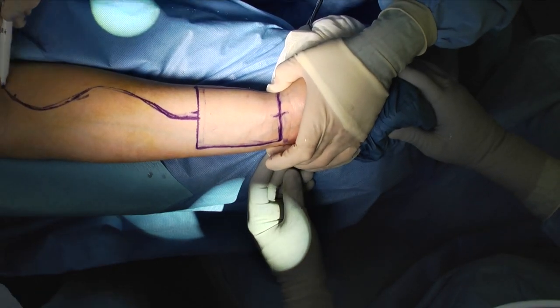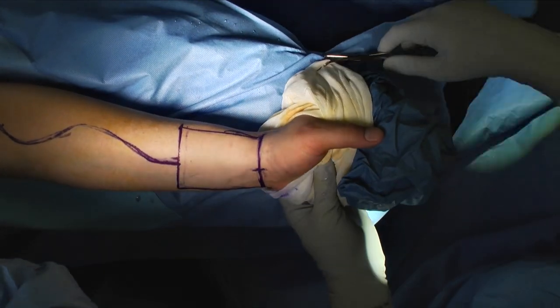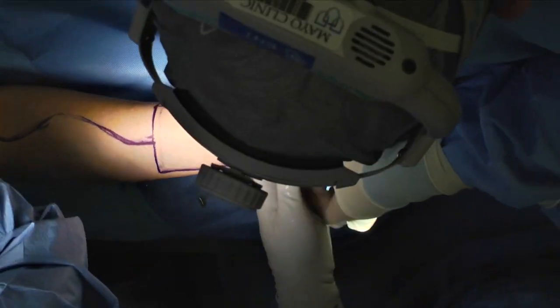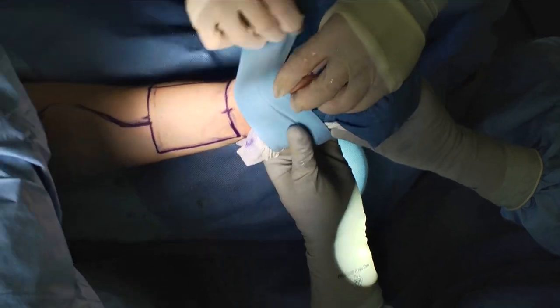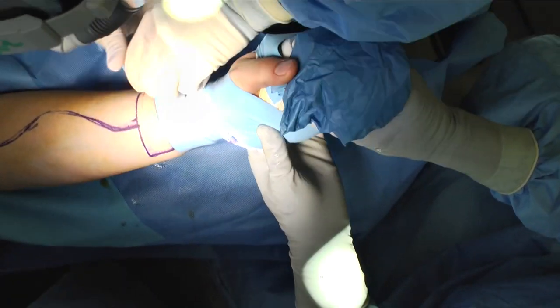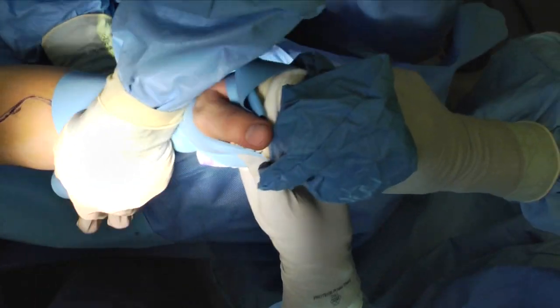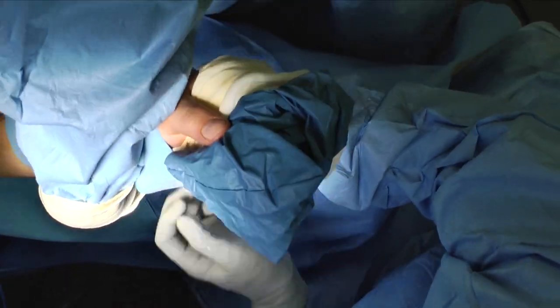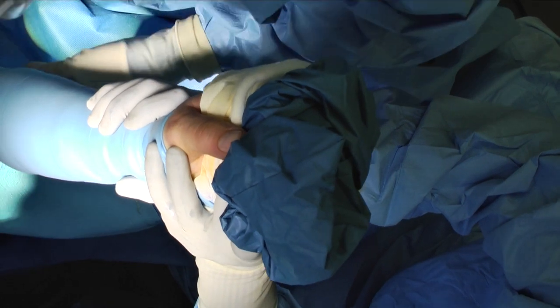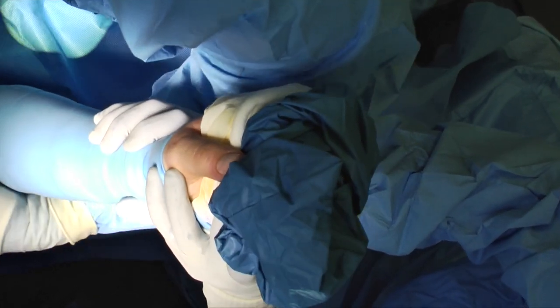The skin panel is centered essentially on the patient's radial artery, and can extend from the antecubital fossa and almost circumferentially wrap around the arm if a large piece of skin is needed, but oftentimes for most upper aerodigestive tract reconstructions, less skin is needed. We then extend a tail off of the proximal aspect of the flap towards the antecubital fossa.